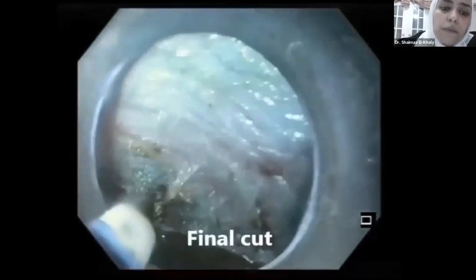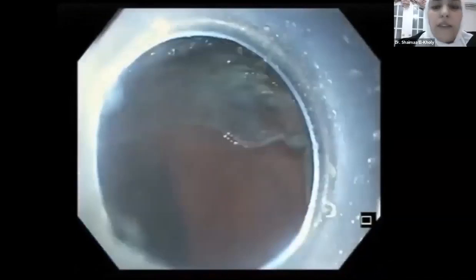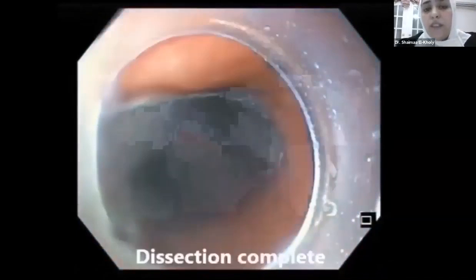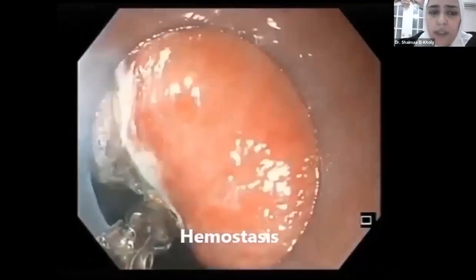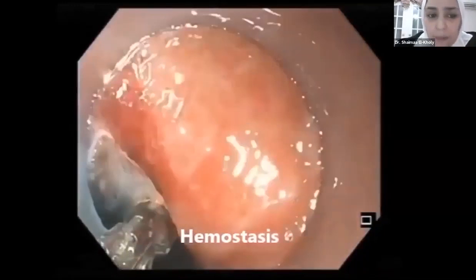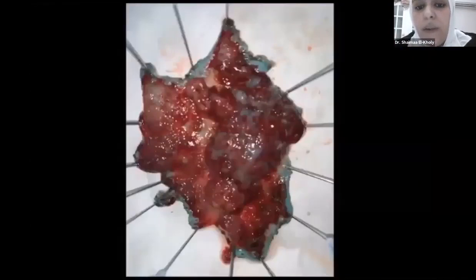And here, there's the final cut. And then there is the lesion bed. The lesion is finally excised. And then, of course, you have to ensure hemostasis. This lesion leaves a big raw area, which may have post-ESD bleeding. So here's our lesion that was removed en bloc.